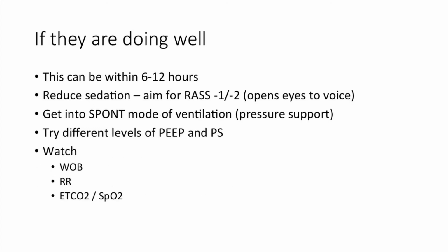So the first guy we ventilated with COVID was doing really well, and once the paralysis wore off, you don't need to keep them in a fully mandatory mode, you don't need to keep them fully sedated. It's okay, and it's a good idea to wake them up. We aim for a RASS, or Richmond Agitation Sedation Scale, of -1 or -2, which means when you say their name, they open their eyes to voice and look around the room a bit. That's what we're aiming for.